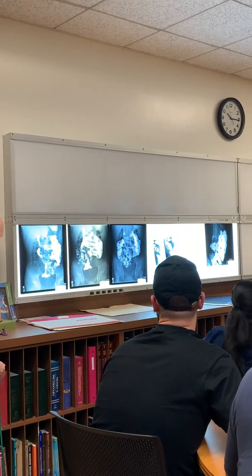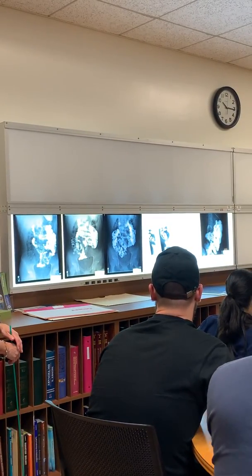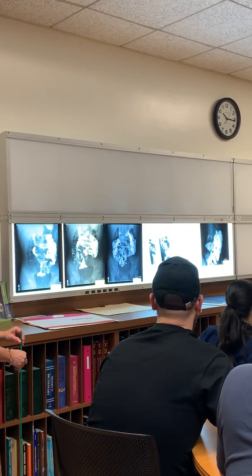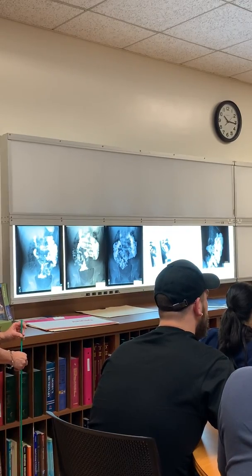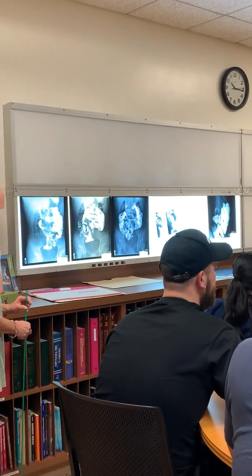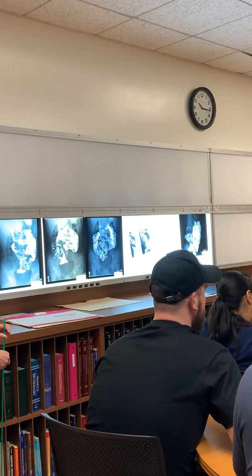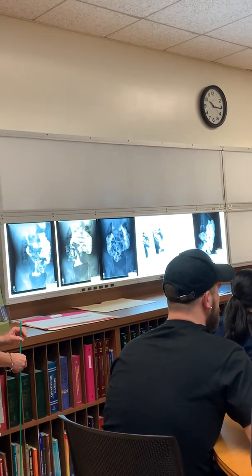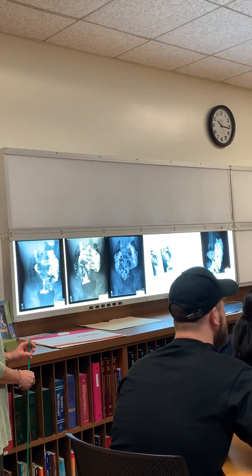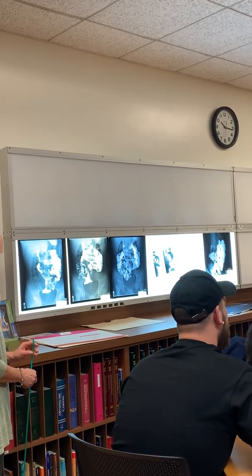It was weird because when we put the contrast in, it was in her stomach and then it started to move and then it just sucked right back into her stomach. What was her problem? Why did she come in? She was an inpatient. We did it with the NG tube and saw it moving. When we put her on her back, it went back in, but when we put her on her right side, it started to go down a little bit. But it was taking forever because she kept going. And then the second one made her use the bathroom, but hers kept moving along great.